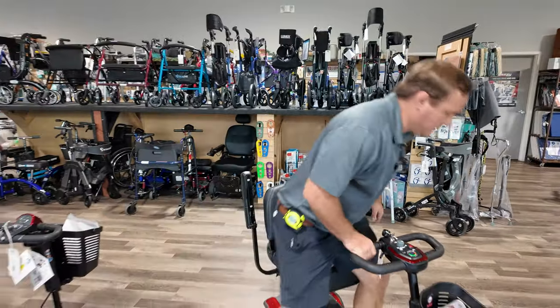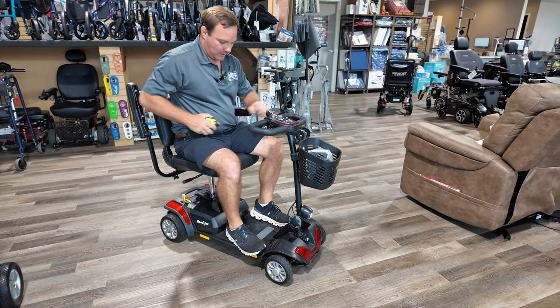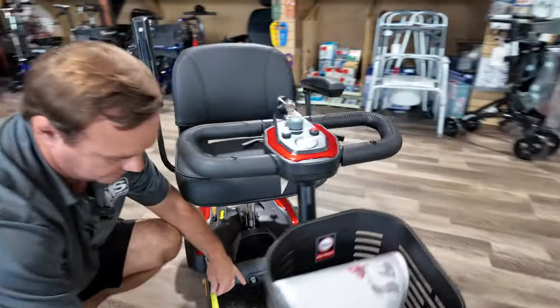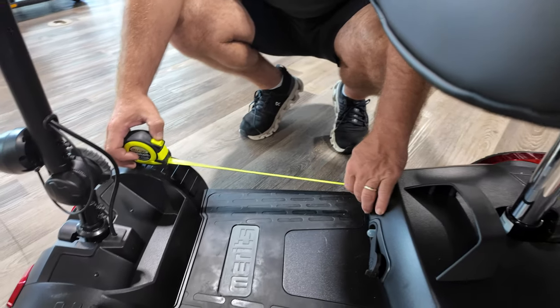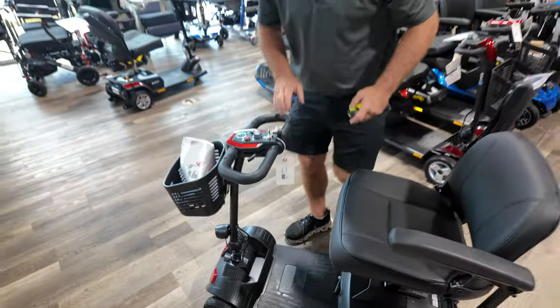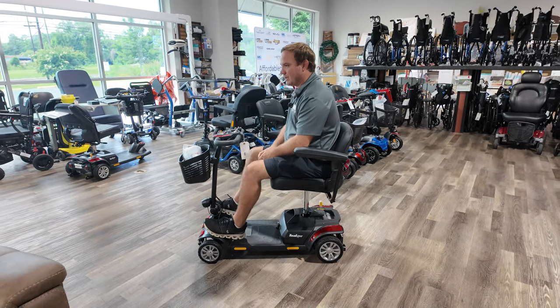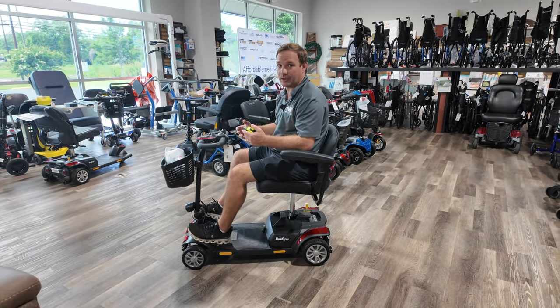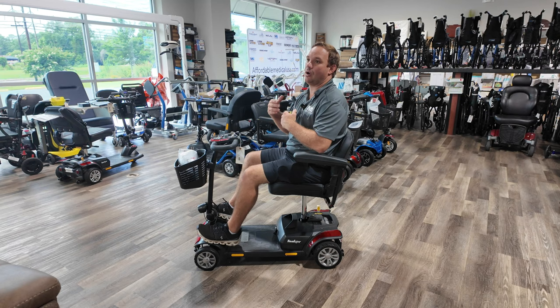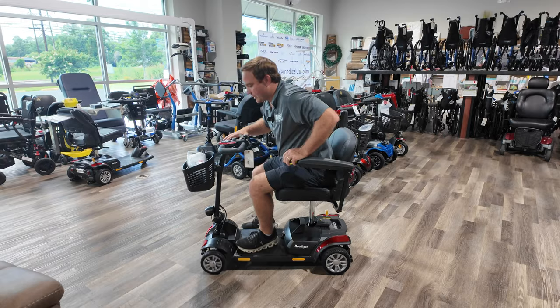I'm about 5'7" and I fit fine. You can put your feet up here — from your foot to the battery is about 12 inches, and you've got about 20 inches to here. If you're six foot and above, you're probably going to feel really tall on this unit, but it's manageable. It's a portable scooter — not something you'd use all day every day, but it's a portable, affordable scooter that disassembles.